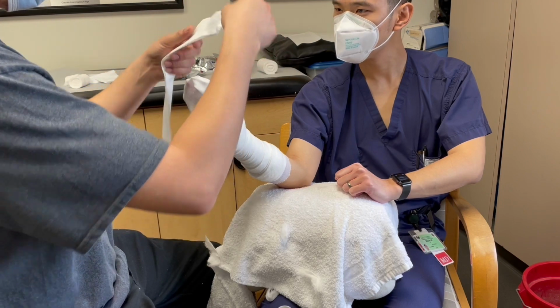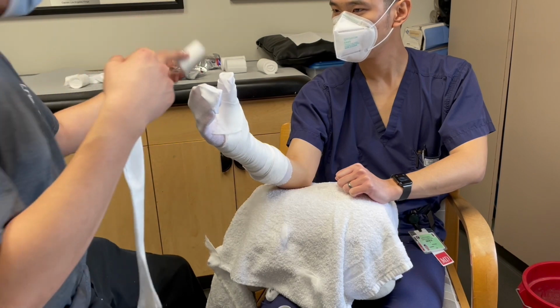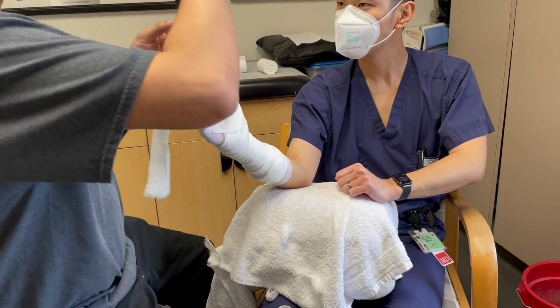Similarly, take the 3-inch padding, fold it in half, and pad the distal end of the cast at the distal palmar crease.